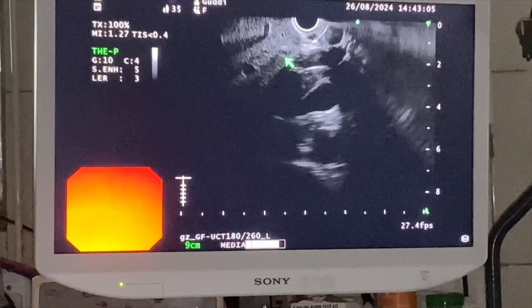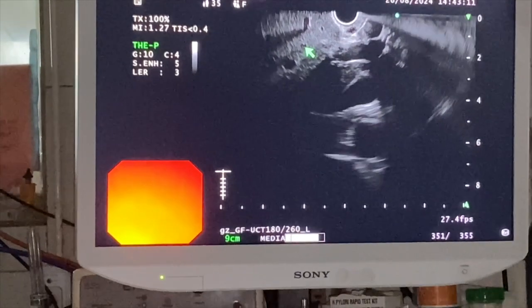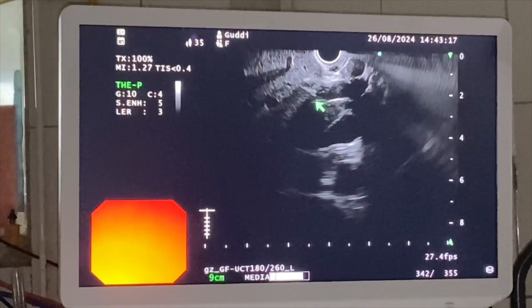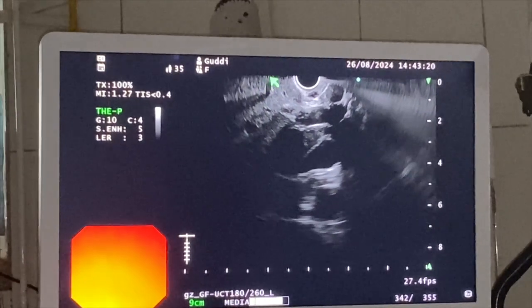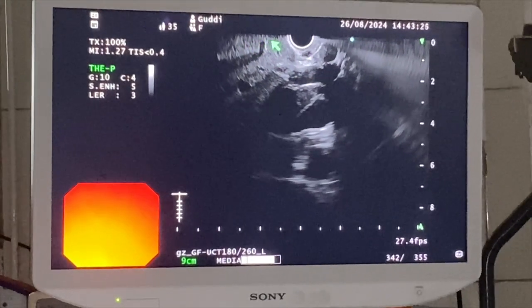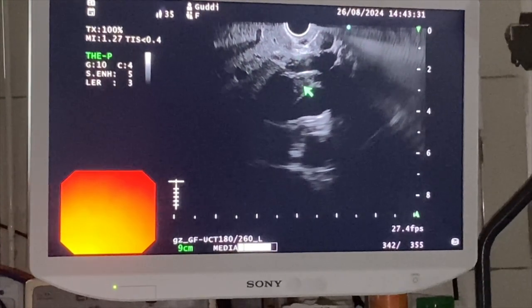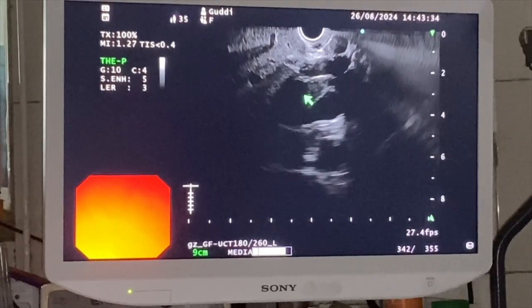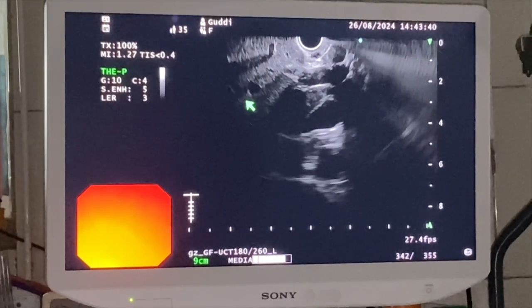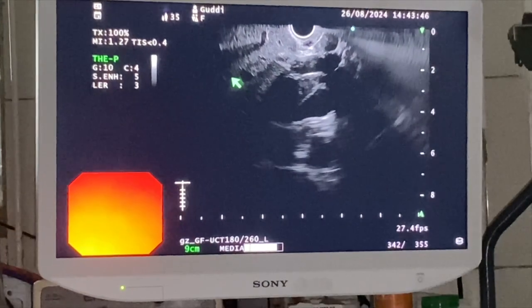and so after we can freeze over. See, this is the right anterior branch, and this is the right posterior branch, and segment over here is the segment 5. Segment here is the segment 6. Segment 5 at the distal end has got a segment 8, and segment 6 at the distal away from the probe is segment 7. So 5, 6, 7, and 8. So these are the segments which one can identify from the first portion of the duodenum, that is the duodenal bulb.